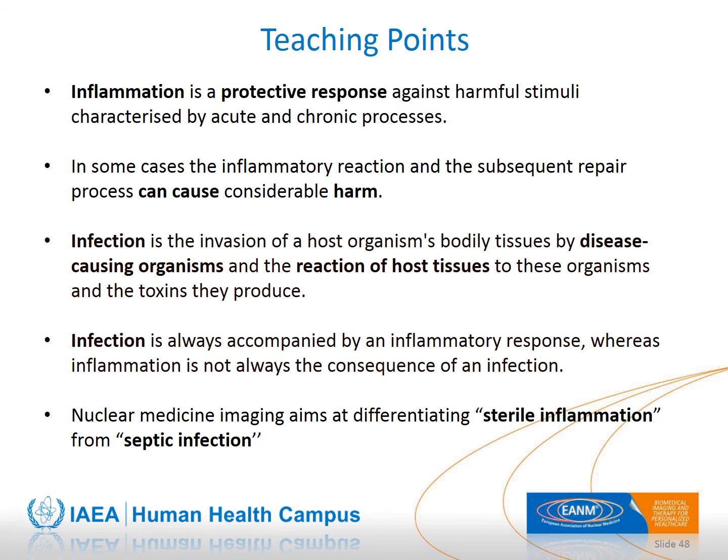Nuclear medicine aims to differentiate sterile inflammation from septic infection. Sterile inflammation rarely requires antibiotic treatment, which is the mainstay of treatment for septic infection.